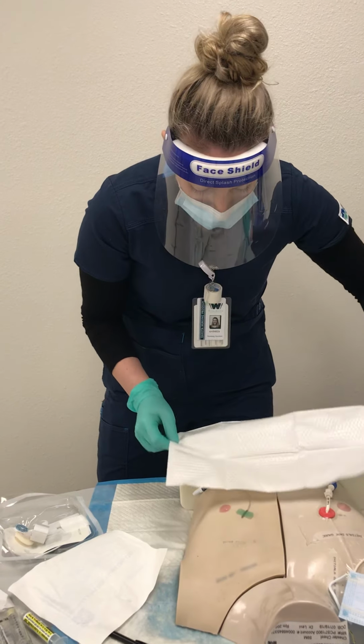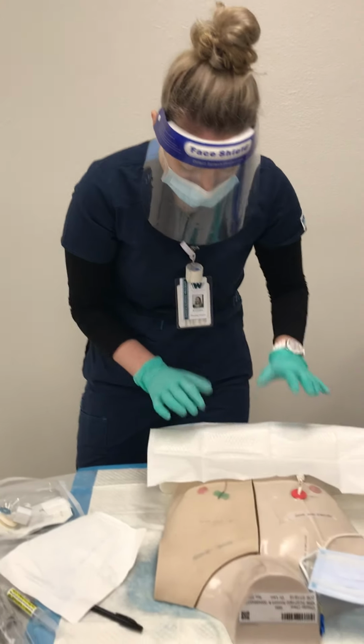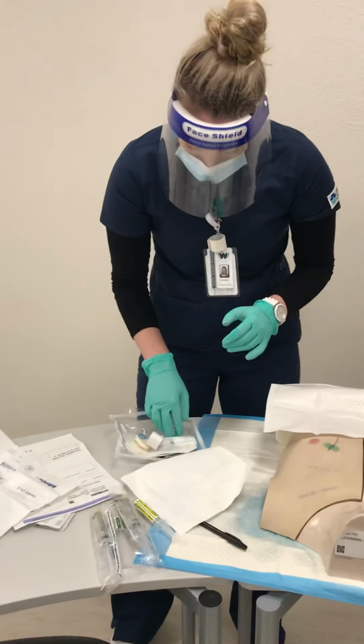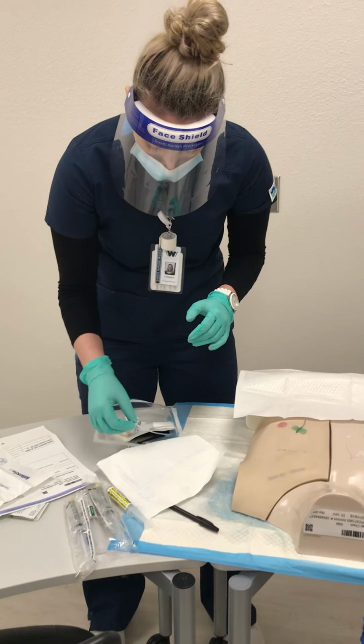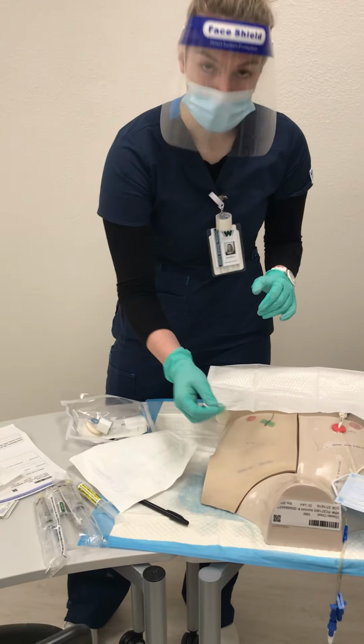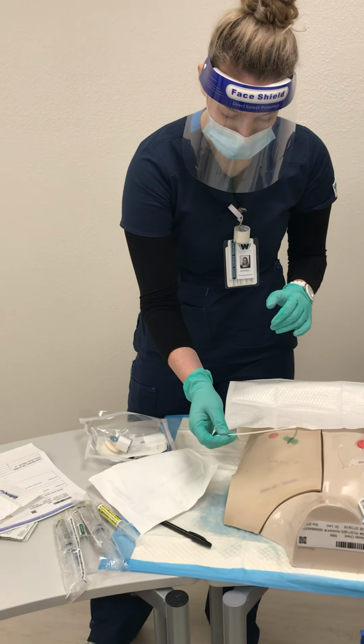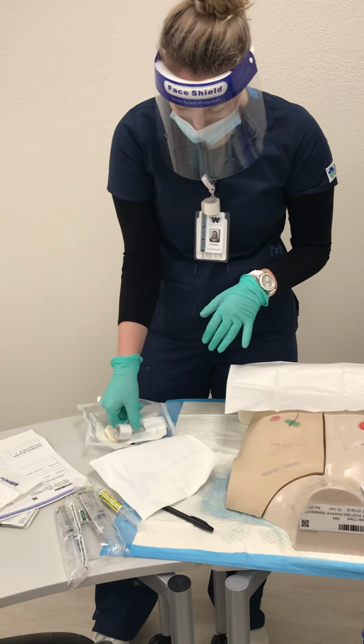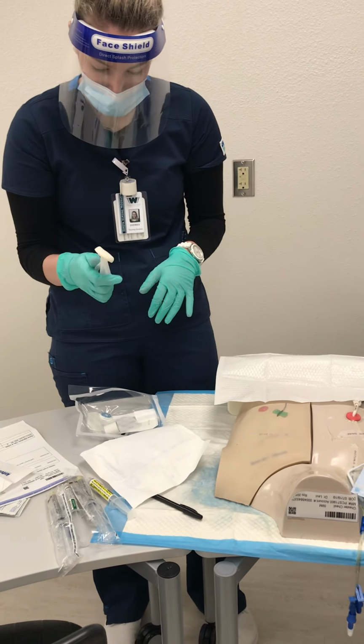And we're just going to put this right over here, making sure to stay sterile and not touching the patient's skin. So then I can grab my Q-tip here as well and get out any gunk that might be around the side of the port. And I can discard of that. And then I'm going to want to clean.